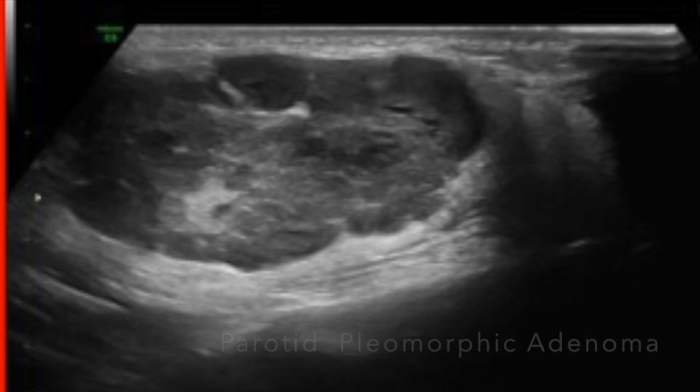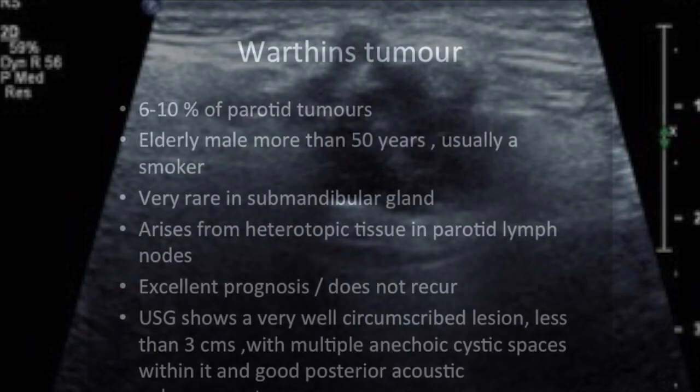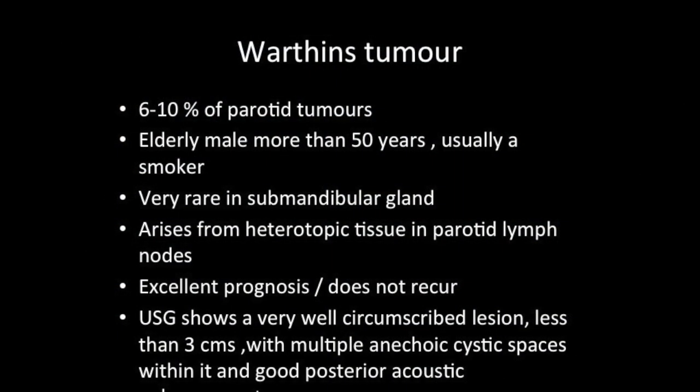Note the lobulated appearance, inhomogeneous texture, and slow-growing character — a mass sitting in the parotid for many many years. Always think in terms of a pleomorphic adenoma.